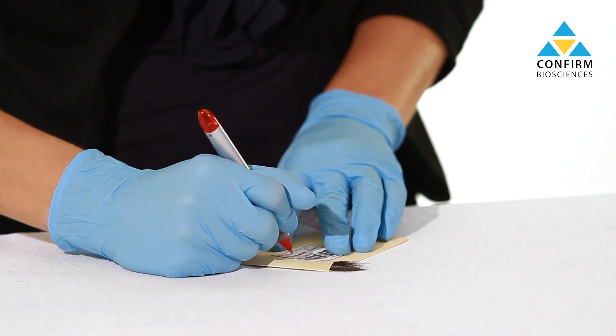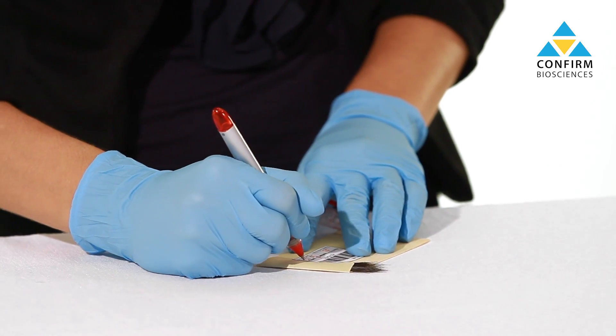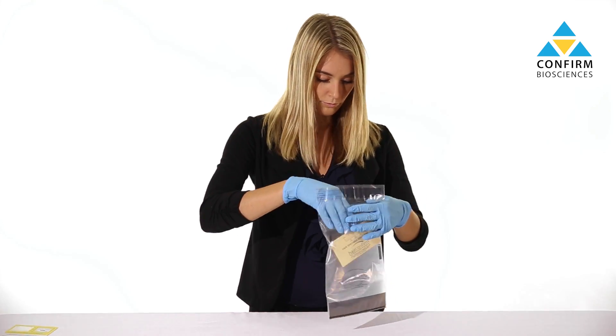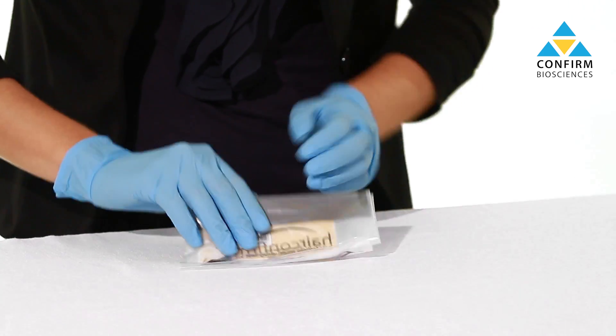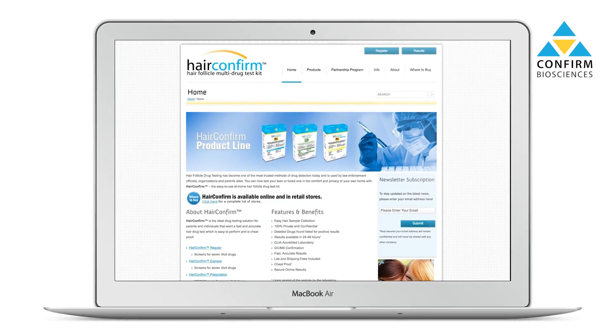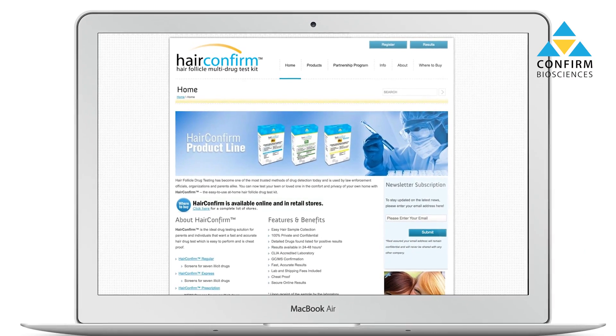You'll use this ID card to register your test and obtain results, so keep it in a safe place. Initial, date, and confirm the hair sample type on the envelope and place it into the clear pouch. Seal this pouch and place it into the prepaid shipping mailer. Before mailing, use the ID card to register your test at hairconfirm.com.